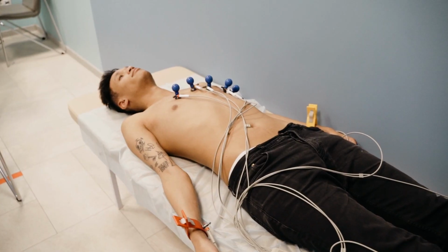But first of all, as a medical student, as a resident, and as a doctor, you should always know and make sure the electrodes are placed correctly, because it's your responsibility. Maybe the nurse misplaced them by mistake. You should always check, especially when you are present when the ECG is being taken. So knowing the colors, knowing the placement of electrodes is quite important, and how to attach it.